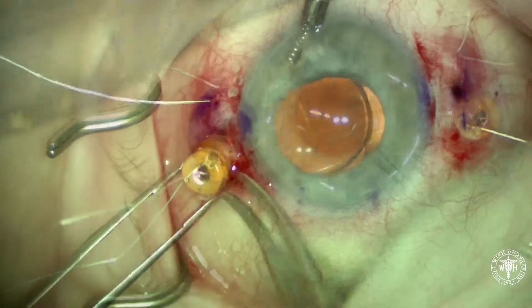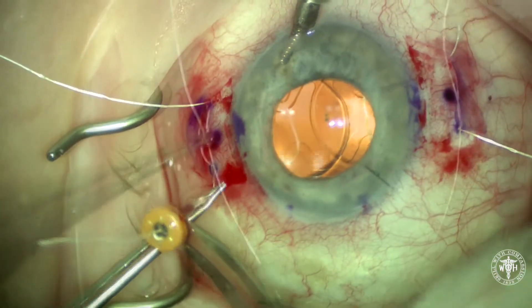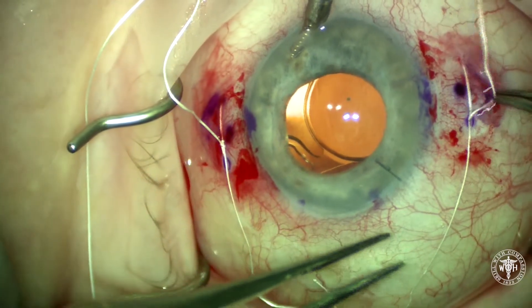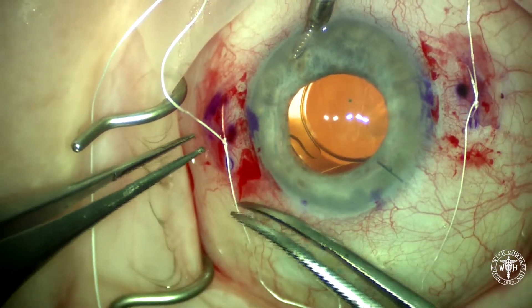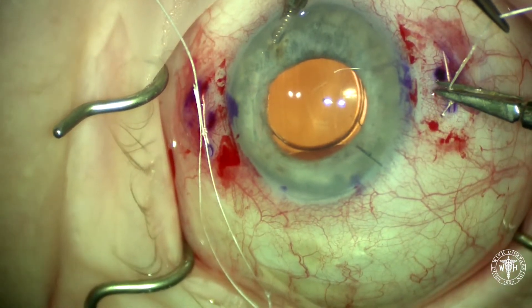Once the implant is in, I like to take the trocars out before tying the knots and centering the IOL. What's tricky about the A060 lens is that it's not big enough to reach sulcus to sulcus, so you have to balance your suture tension, adjusting one and then adjusting the other to get good centration of the IOL in the visual axis.